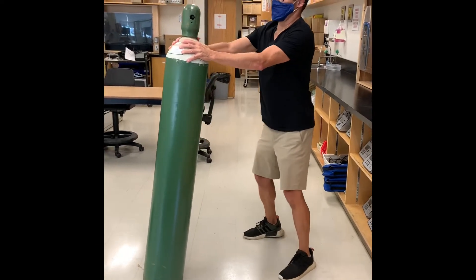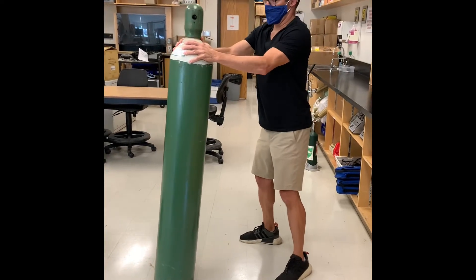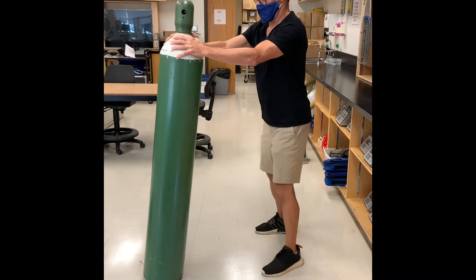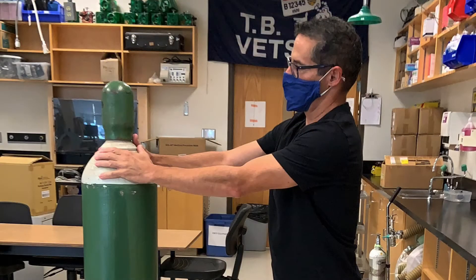You also don't want the cylinder too straight up, because if it's too vertical, it's hard to maneuver as well. Keep the cylinder in the middle of your body, and if it's starting to feel like you're losing your balance, stop and put it straight up and down so that you can regain your balance.